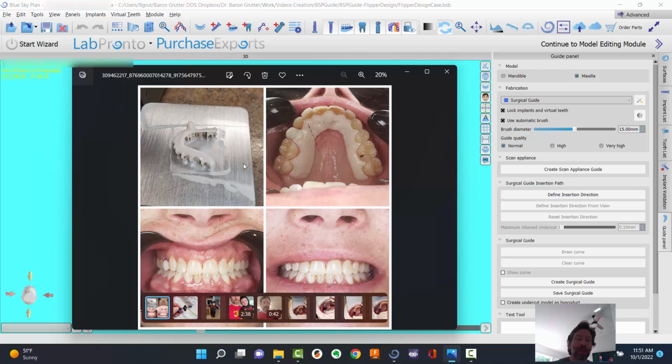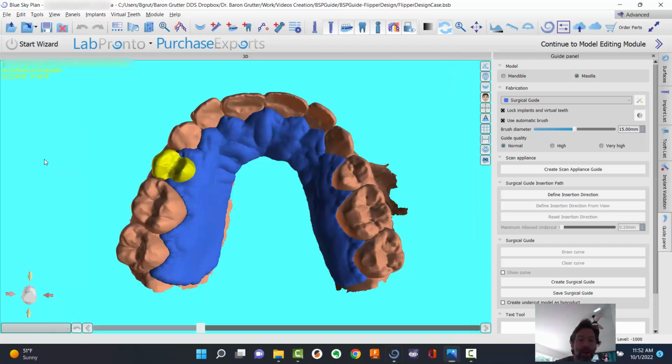And also, I've got another video I'm going to make next week on how to polish these super cheaply and easily and predictably. I was really surprised at something I figured out this week, just a specific brush that did a beautiful job with it. But anyway, yeah, hopefully that helps. You can provide these short-term, temporary measures for your patients that aren't so excited about losing a tooth. And it doesn't cost me any more because I'm already going to be exporting the guide anyways.